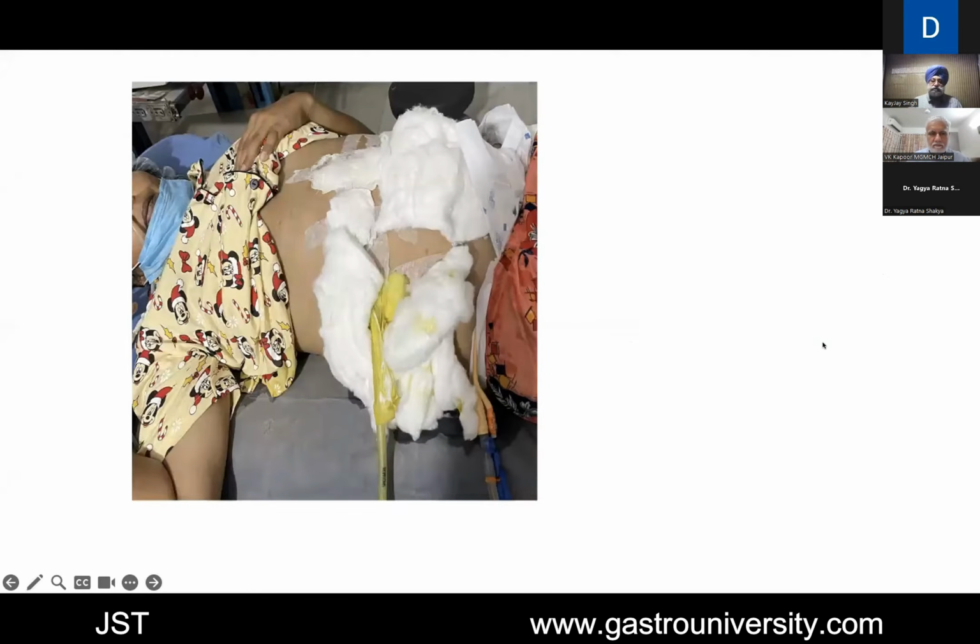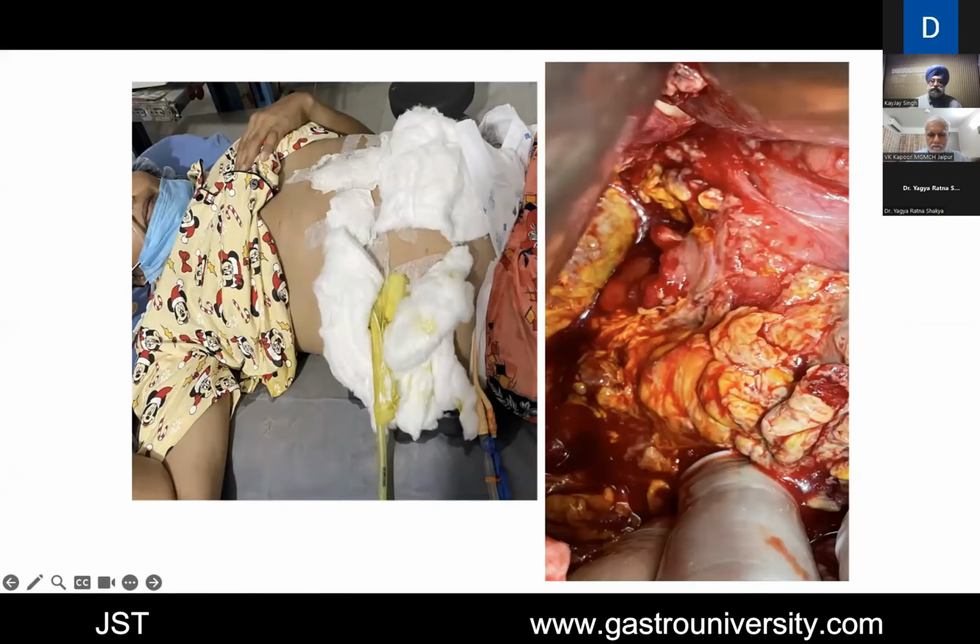So this is a patient. This site is quite familiar to us GI surgeons. And here, you see, there's a large duodenal perforation, almost nearly the bend of the duodenum. And this could not have been anything except a mishap from the cautery. I'll revisit what we need to call cautery. Whether it's a technical complication or a technological complication is as good your guess as mine.